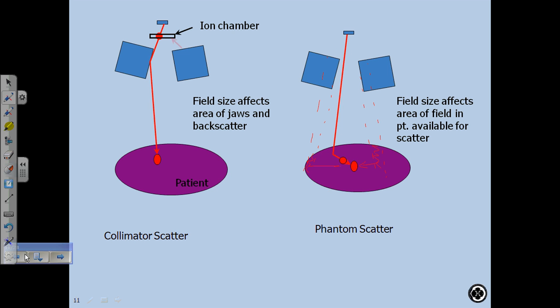So what happens if there's radiation coming from another source, along with the radiation that's going right through it and heading to the patient? There's another source of radiation that it's measuring. What would happen to the beam? The beam would shut off quicker. It would shut off quicker. Okay, and that's exactly what happens.